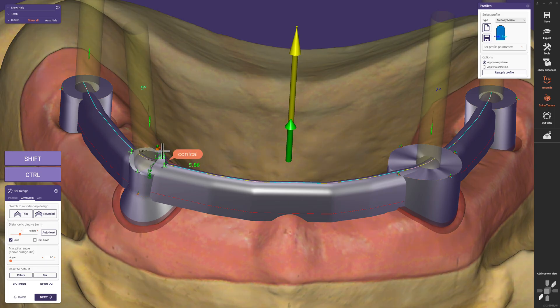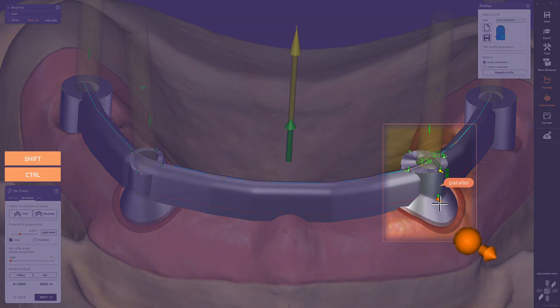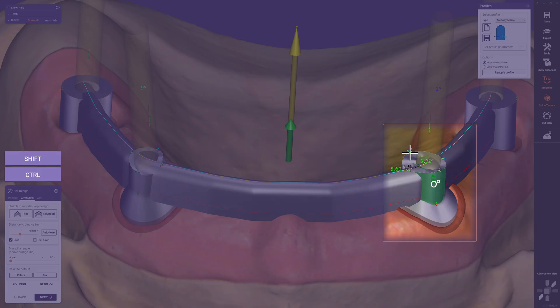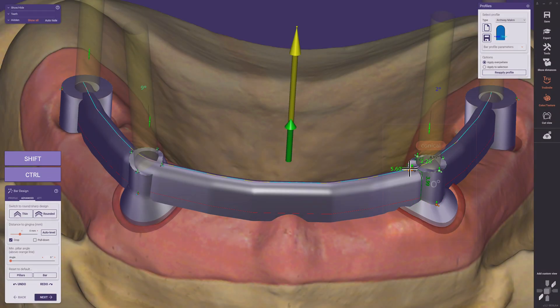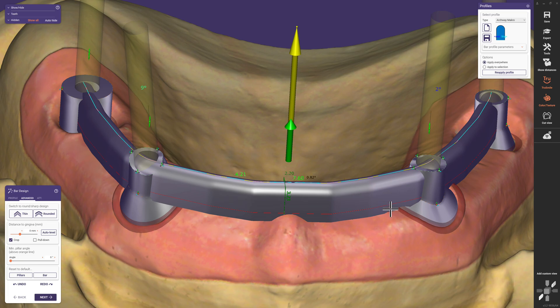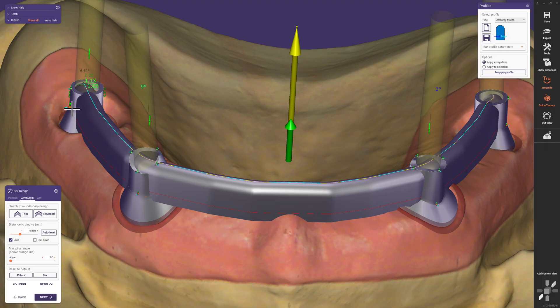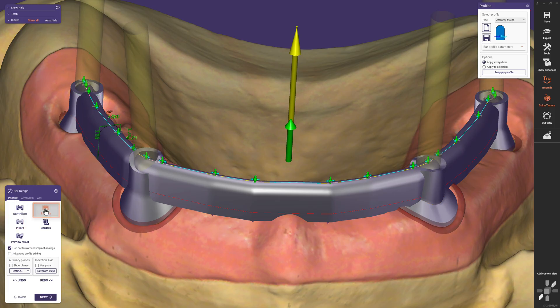We still have the freedom to increase the angle to get a more conical design where needed. We repeat this step for all bar pillars — moving the control line inwards by holding CTRL+SHIFT for a parallel pillar angle, or increasing the angle individually as desired. Looking at the dorsal pillars, we can clearly see the impact of the emergence profile on their shape: leaving it as-is results in a minimalistic, perfectly circular pillar, while following the gingival margin gives a more individualized design, as we did on both canine teeth. One last time we add a control line to ensure all pillars follow the desired parallel angle.